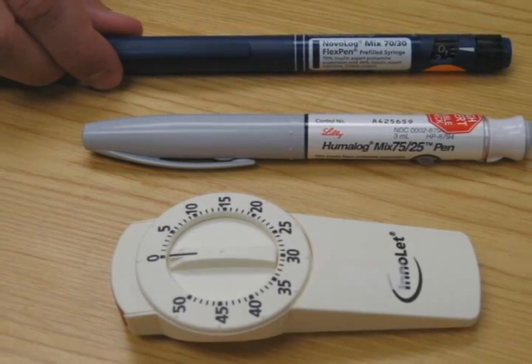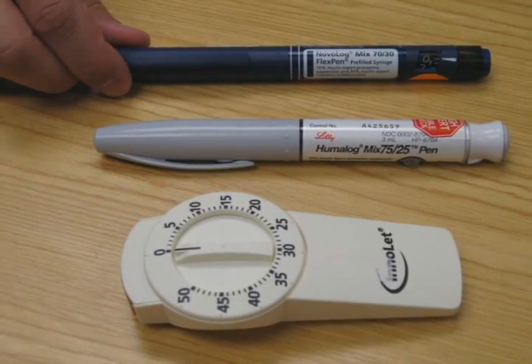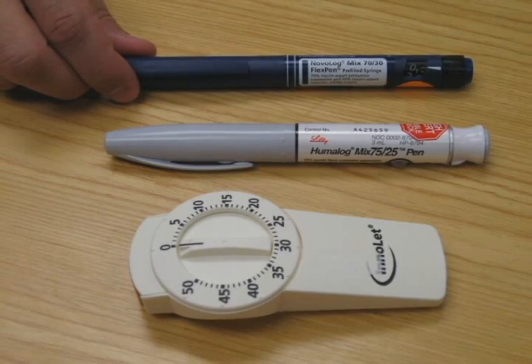In addition to vials, you may receive your insulin in the form of a pen. Many types of insulin come in this type of administrative device. There are some differences among them, but they all basically work in the same manner.